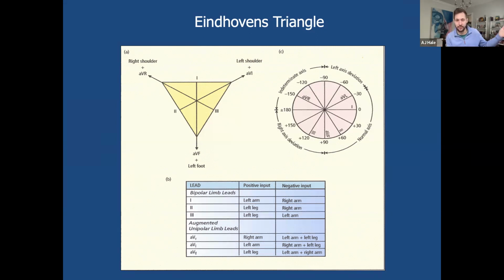Because it was placed 5 years ago, and now we're doing follow-up because they have heart failure symptoms. But what we're trying to do is get the most electrically narrow QRS. So we can use our surrogates in the EGM and then compare it to a surface 12-lead EKG and just try to optimize for the most narrow, electrically efficient QRS, I guess is the way I'd say it.